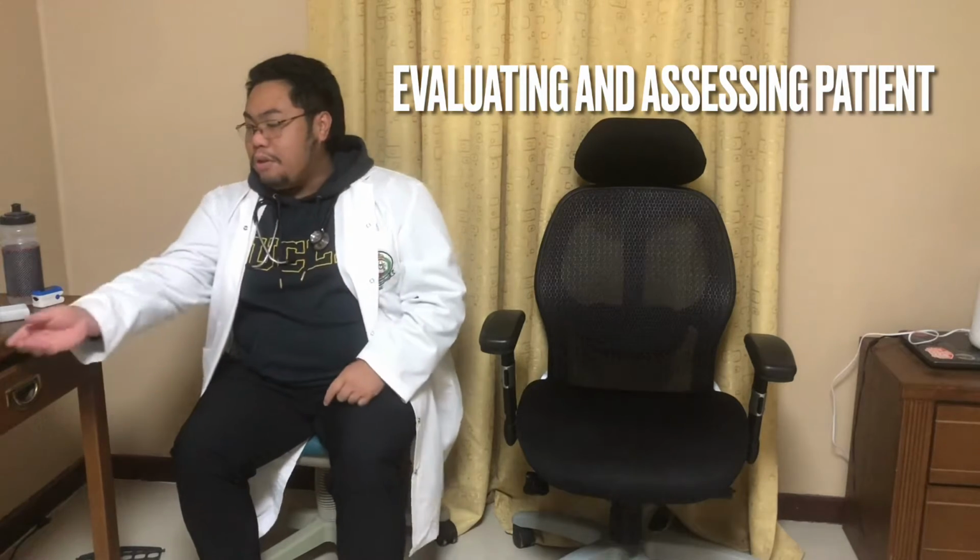After giving the basic information for the MDI administration RD, now let us proceed to the actual performance of the RD. Before, we should always make sure to check the physician's order and the patient's chart. Okay, it's all good. Now we need to gather all the equipment and make sure that the medicine you're giving to your patient is prior to the expiry date. All of them are here, and let me check the expiration. Yeah, it's all good.